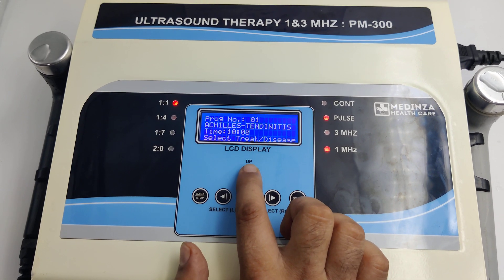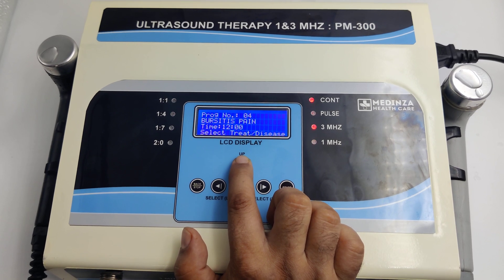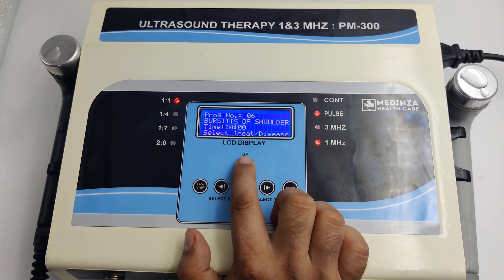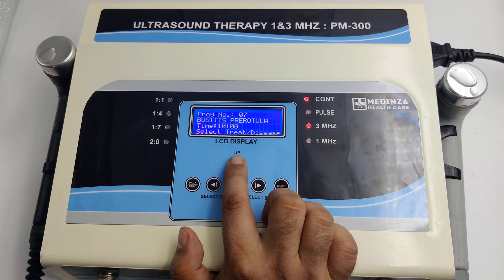Program number 1, program number 2, program number 3, program number 4, program number 5, program number 6, program number 7. The program list goes up to 45 programs.